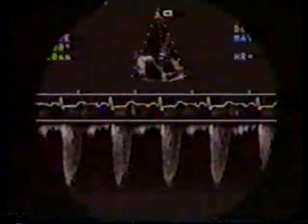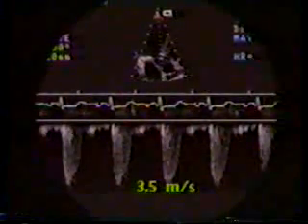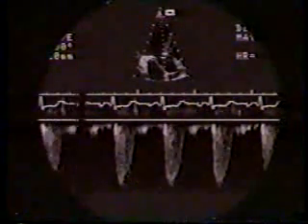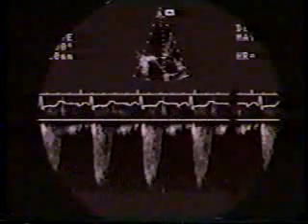On continuous wave Doppler interrogation, the peak velocity across the stenosis measured 3.5 meters per second, indicative of a moderate degree of obstruction. Note again, absence of aortic regurgitation. We will now discuss 2D and Doppler features of pulmonary stenosis. This is a parasternal short axis view of a 93-year-old patient with severe pulmonary stenosis. This patient presented in severe congestive heart failure with low output syndrome.